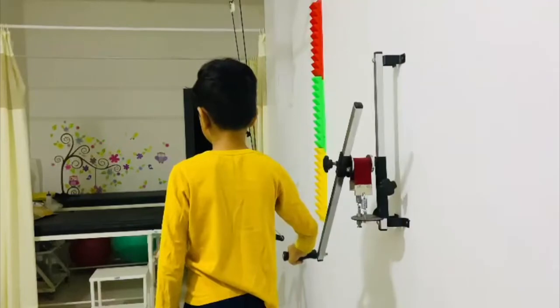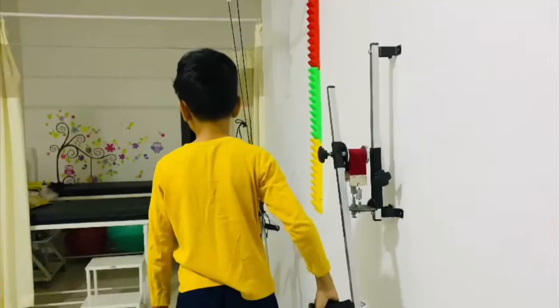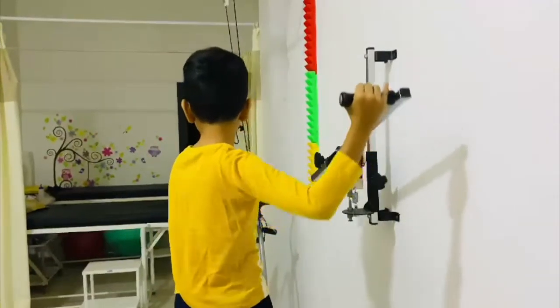Grab the handle and move the bar or shoulder wheel in clockwise and anticlockwise directions, 15 times each.